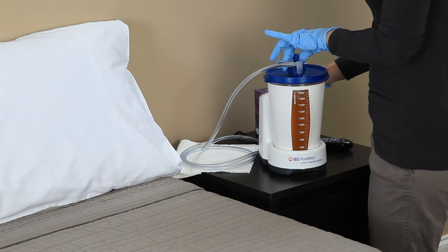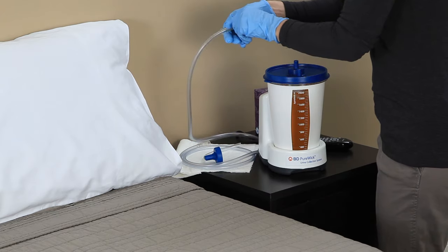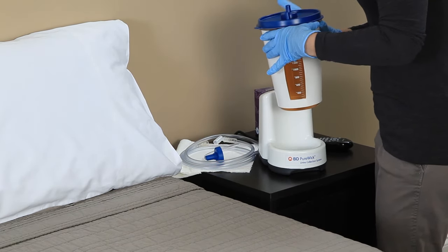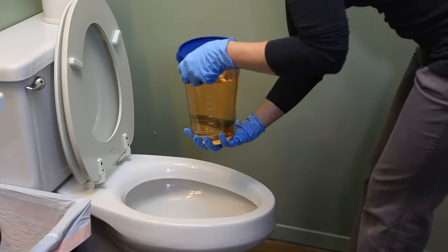Disconnect collector tubing and pump tubing from the canister. Lift the collection canister from the Purewick urine collection system. Do not lift the canister by the lid. Take the canister into a bathroom for disposal.